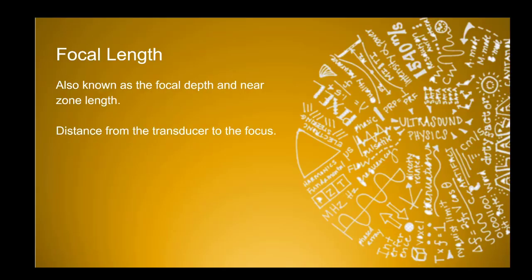The focal length then is a depth measurement. It is going to be from the transducer face to the focus, and it actually is also the length of the near zone.